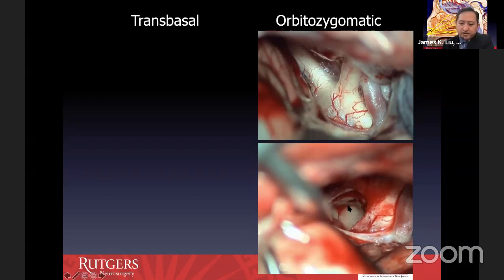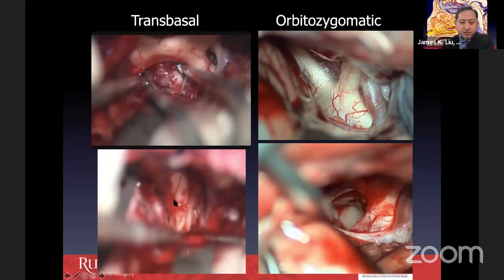And your opening is oblique. And so you have a blind spot on the ipsilateral optic nerve, and you won't be able to see this wall of the ependymoma. Whereas with a midline approach, you have a great view of both walls of the third ventricle.